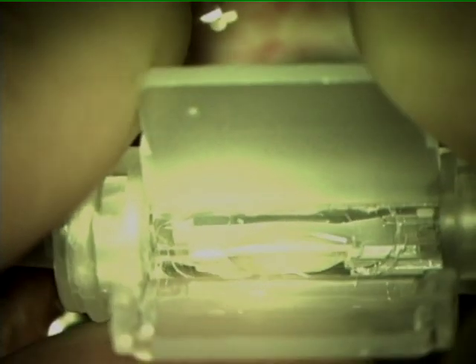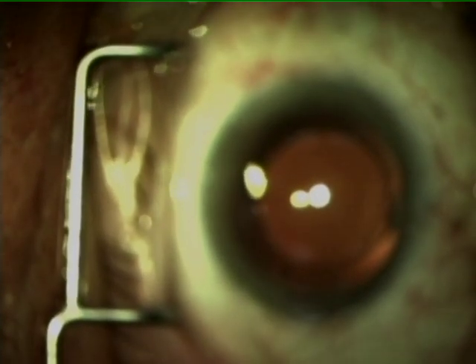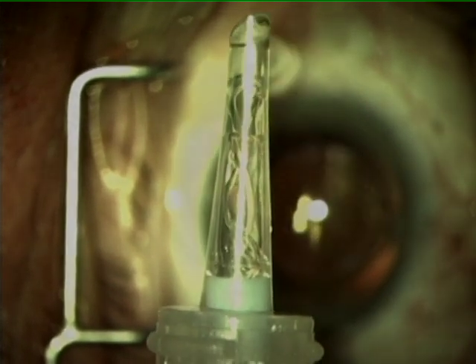If preferred, this may be facilitated by gently depressing the optic to ensure that no part of the IOL is trapped before finally closing the wings, and the lens is advanced with a slow, continuous and controlled movement of the plunger into the nozzle ready for implantation. Note how the lens moves easily and progressively without any undue resistance.